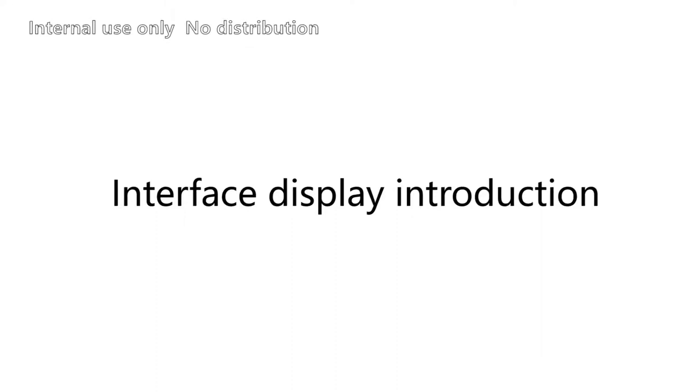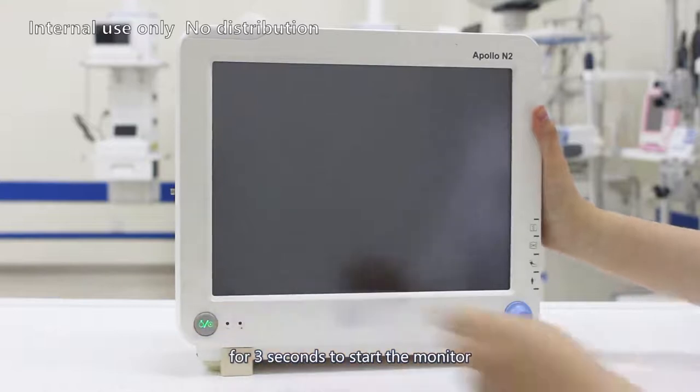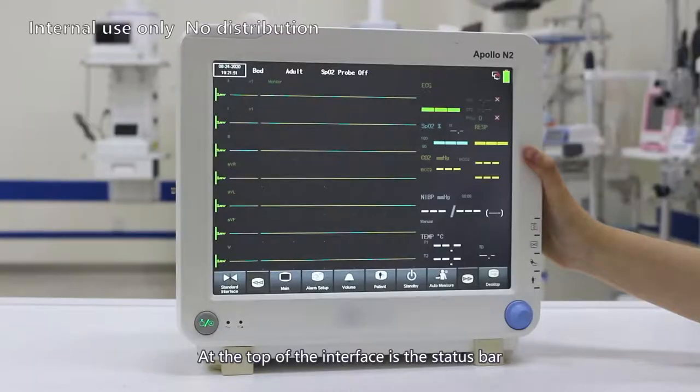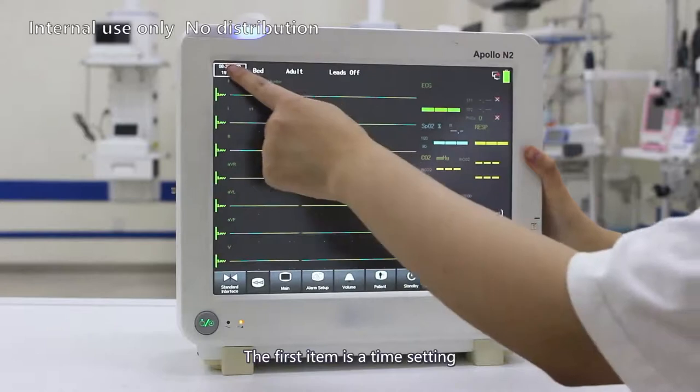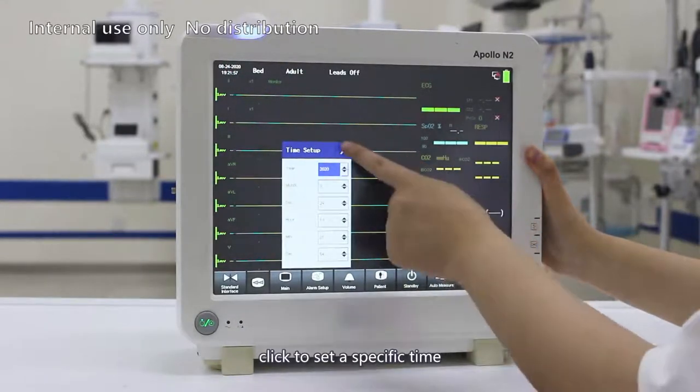Interface display introduction. Press and hold the power button for 3 seconds to start the monitor and enter the operation interface. At the top of the interface is the status bar. The first item is the time setting. Click to set the specific time.